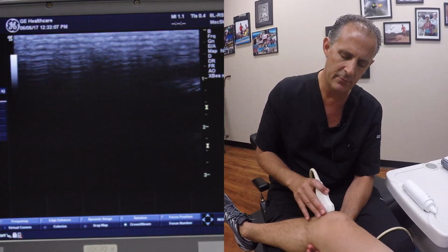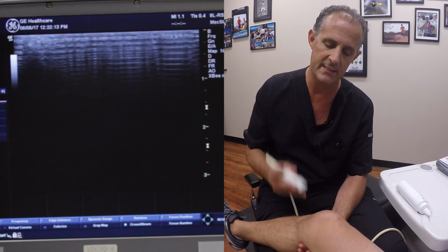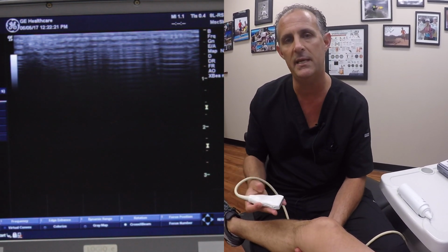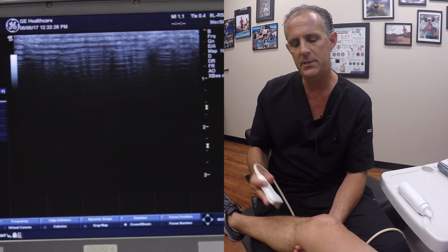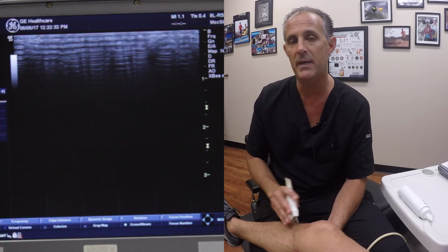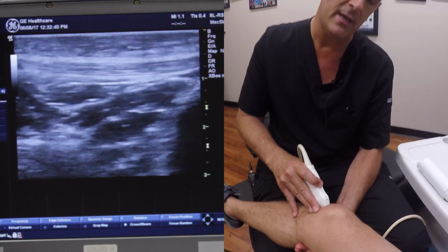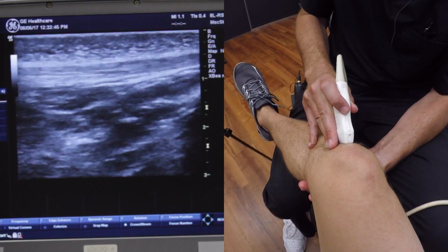Yeah, exactly. And with no disrespect to MRI, it's incredible technology, and it's an amazing tool for when it's needed. A lot of times ultrasound can come up short, and we're just not sure, and we say, okay, let's step it up and bring an MRI in and see what they think. So it's not really in any way intended to replace the MRI. It just is a new tool to be used at the bedside that can take us in that direction. You might not need the MRI if we get a good enough view with ultrasound, and oftentimes we do. And then on that note, a lot of times the MRI misses certain things that could provide a new set of challenges.